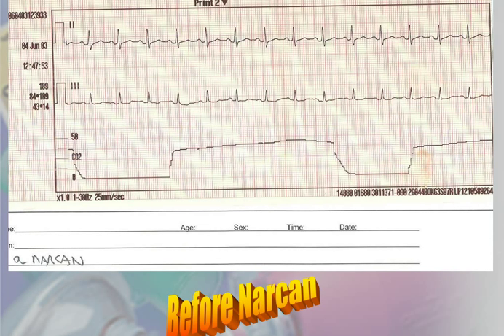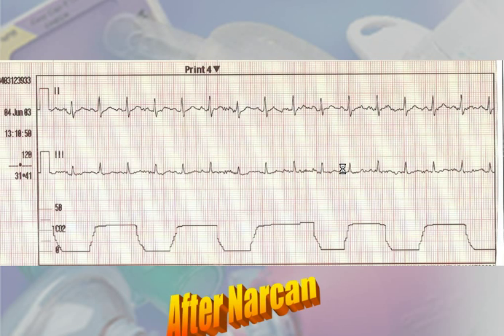All right, so here's our end-tidal CO2. You can see here what it looks like. Pretty high. But this is our line for 50. We're probably at 48, 49, and it doesn't look like it's too much better. It's an overdose. So this is what it looks like after Narcan. And we went from a range of 50. Now we're at 40. Here's 30. So, I'm sorry, 35, 45, 50. So, you're looking at probably 38, 39. So, that's pretty good.